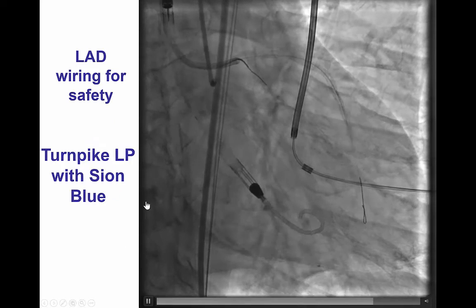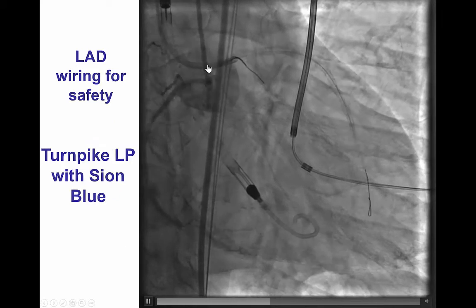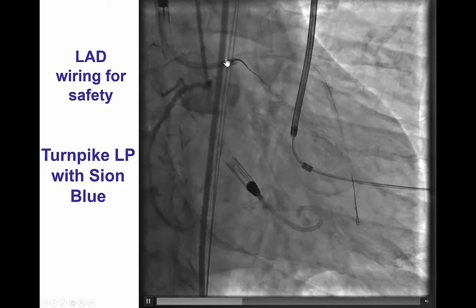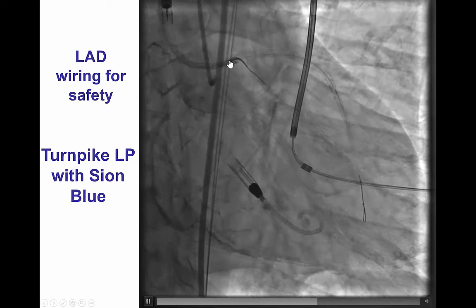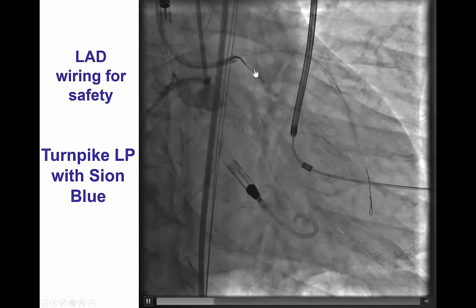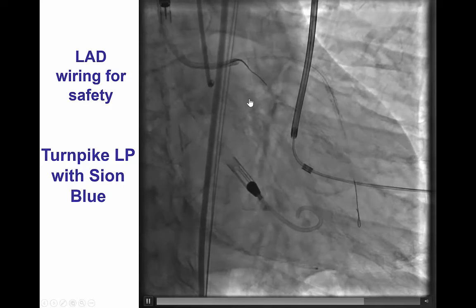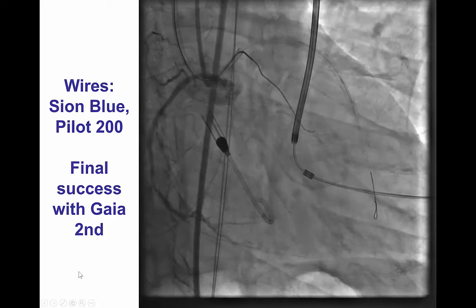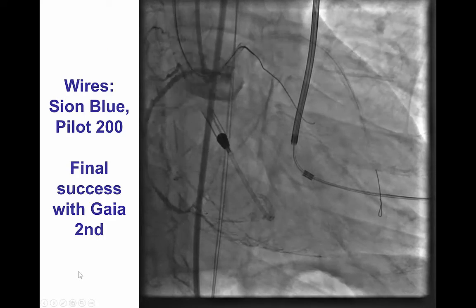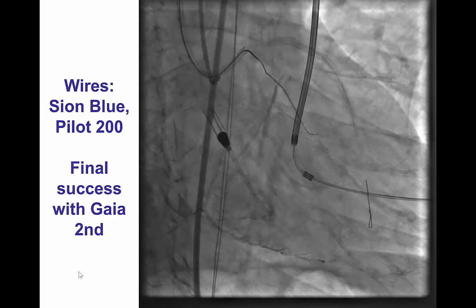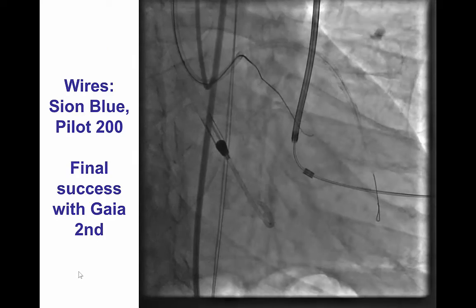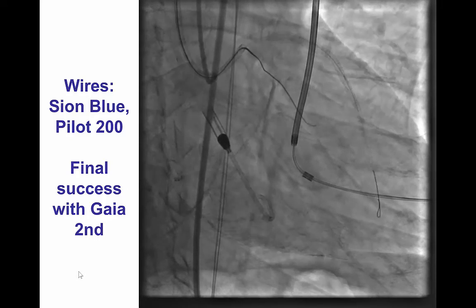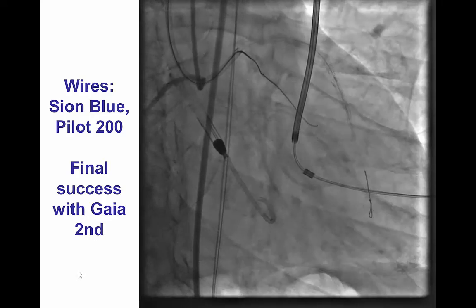After doing that, we were able to go with antegrade wire escalation. This is a Turnpike LP microcatheter over a workhorse guidewire that advanced nicely to the proximal circumflex close to the distal cap at the bifurcation. We tried crossing with the Pilot 200, which was unsuccessful, but we were able to cross into the distal true lumen using a Gaia 2nd guidewire.